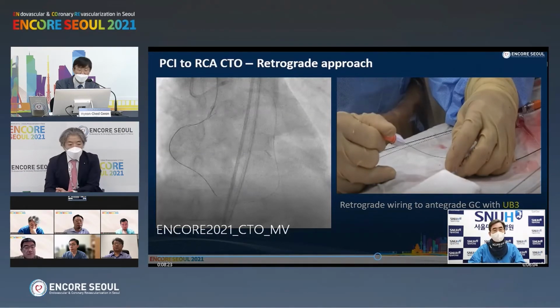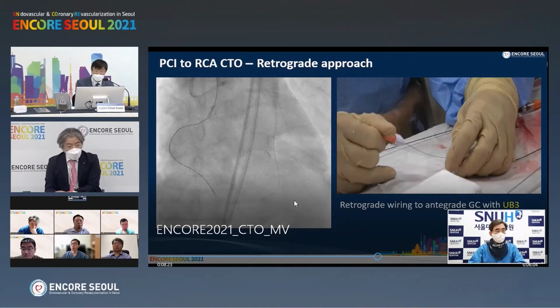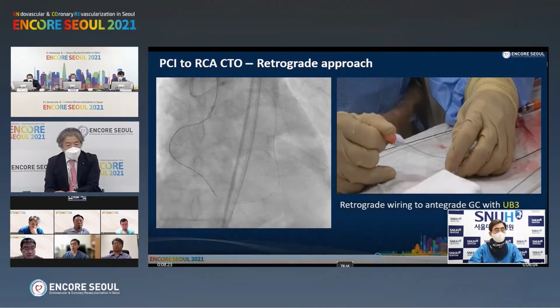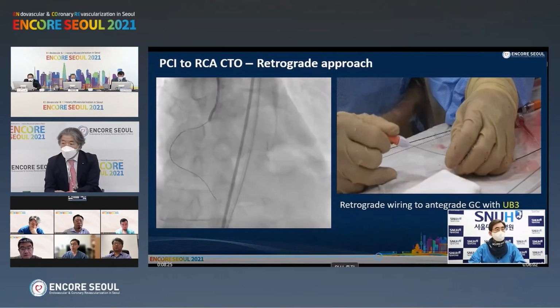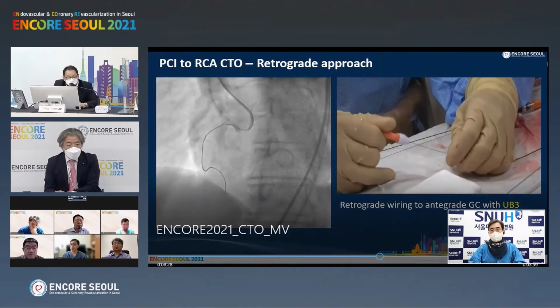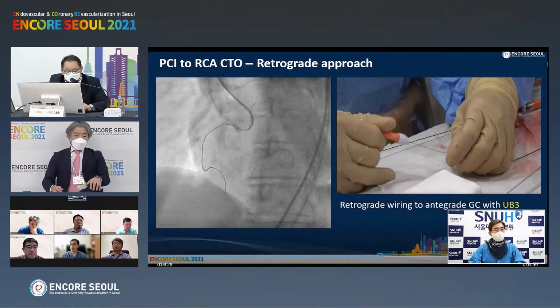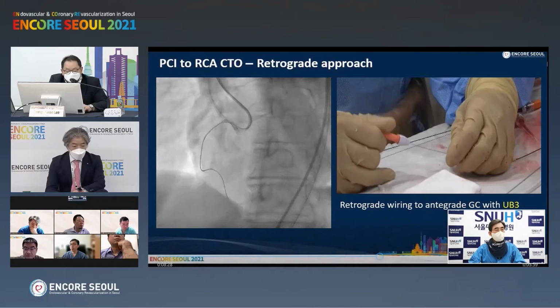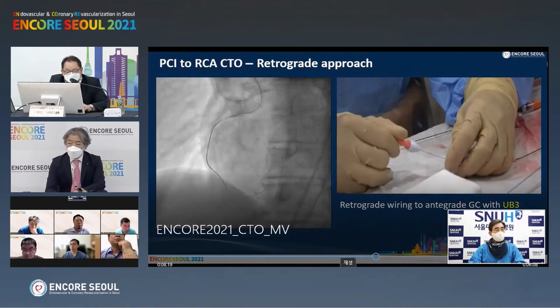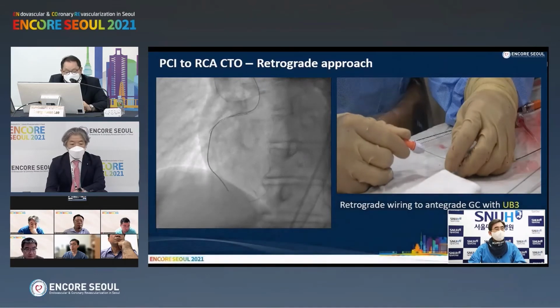UB3, the final is UB3. Of course, previously I made a retrograde channel with Gaia second and third. I just tried to use UB3 to make a new direction channel. Dr. Kim, usually I change my strategy depending on time. In other words, if you spend 20 or 30 minutes and then change your strategy.